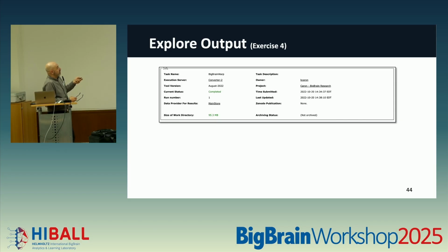So at least we know how it's organized. And it tells you also the size of the output, right? So sometimes you're saying, okay, well, how much space am I using? You, in the end, want to share it or download it to your local system for further offline analysis. You at least want to know what data you're dealing with, okay?